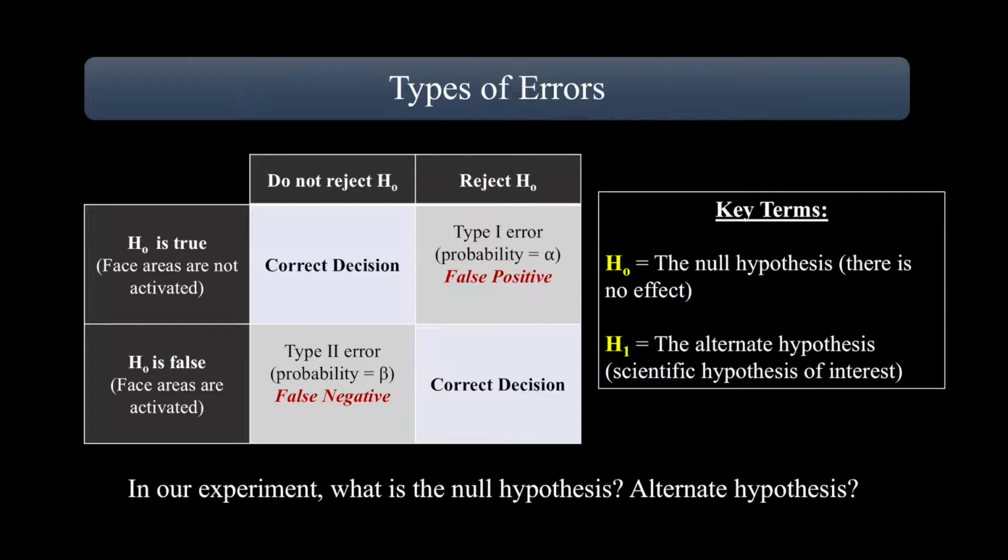Type 1 errors refers to the rate of false positives. In other words, things that are shown to be true by our analysis but are actually incorrect, as you can see indicated on the table. Examples of type 1 errors include voxels that are activated by chance. Type 2 errors refers to the rate of false negatives. In other words, things that are shown to be untrue by our analysis but are actually true. Examples of type 2 errors include voxels which should be activated but are not.